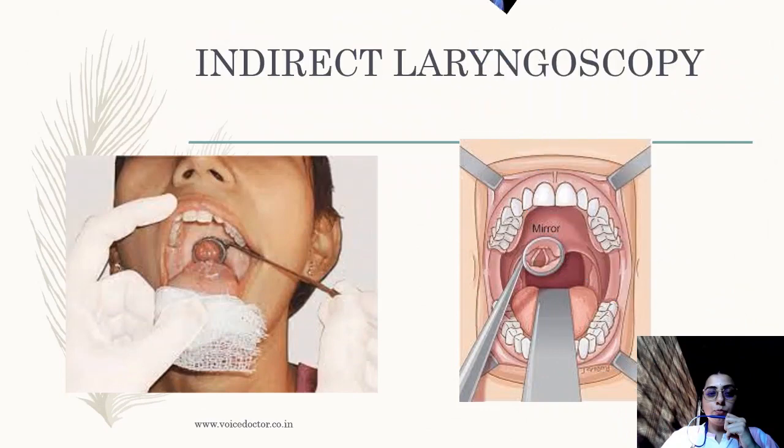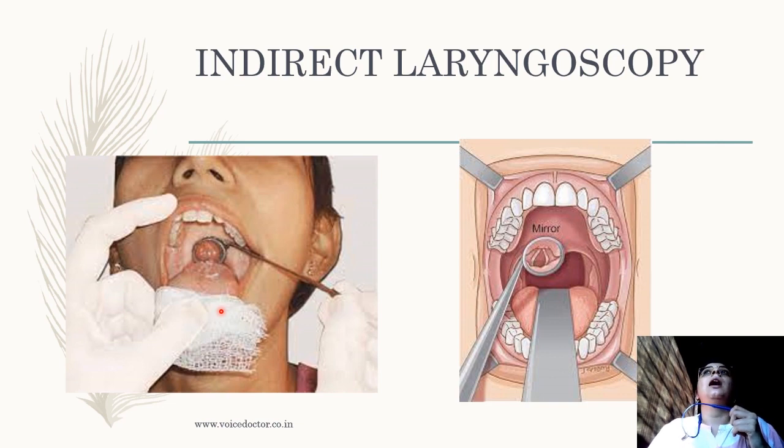Now moving on to the first thing which came in the 18th century, indirect laryngoscopy. Indirect laryngoscopy is a procedure in which ENT surgeons all around the world are very well trained. In this, the patient is made to sit in front of you. You can perform this procedure in your OPD setup. The patient will sit in front of you in a panting position, sitting a little ahead, tongue out, and with one hand you will hold the patient's tongue, and with the other hand you will insert a mirror which has been warmed.